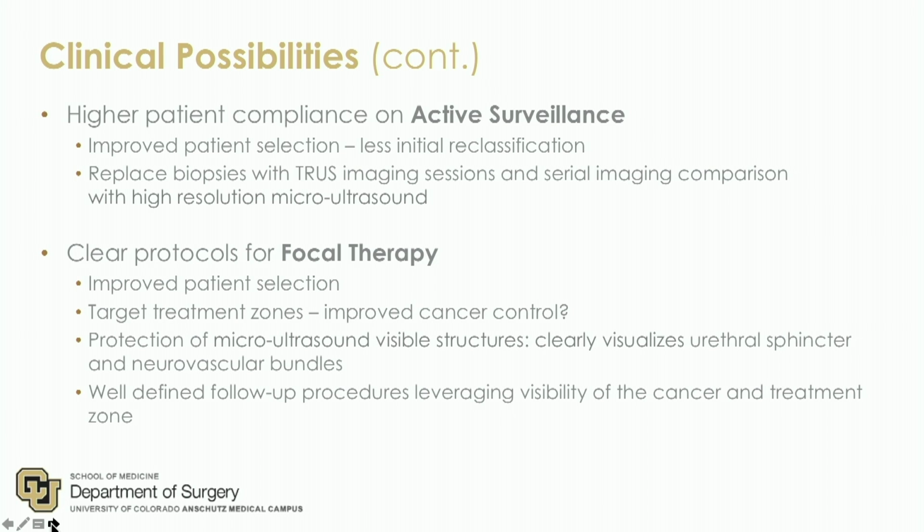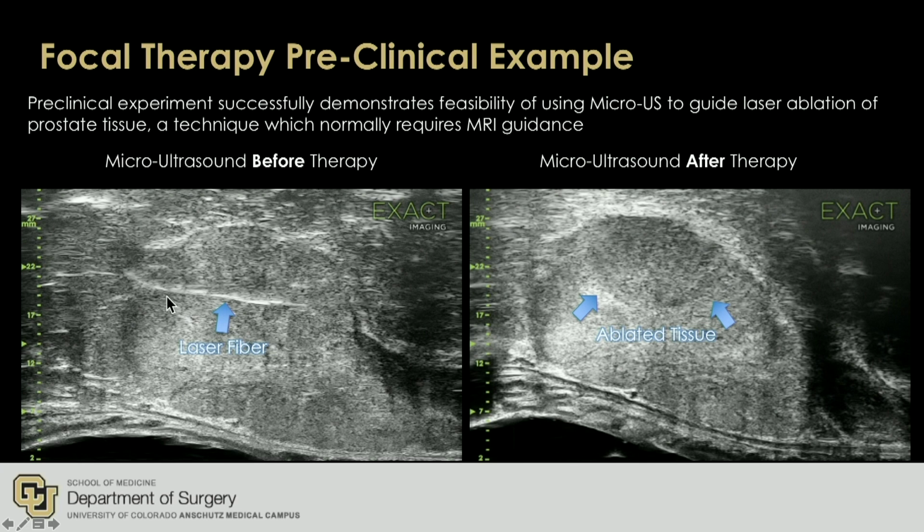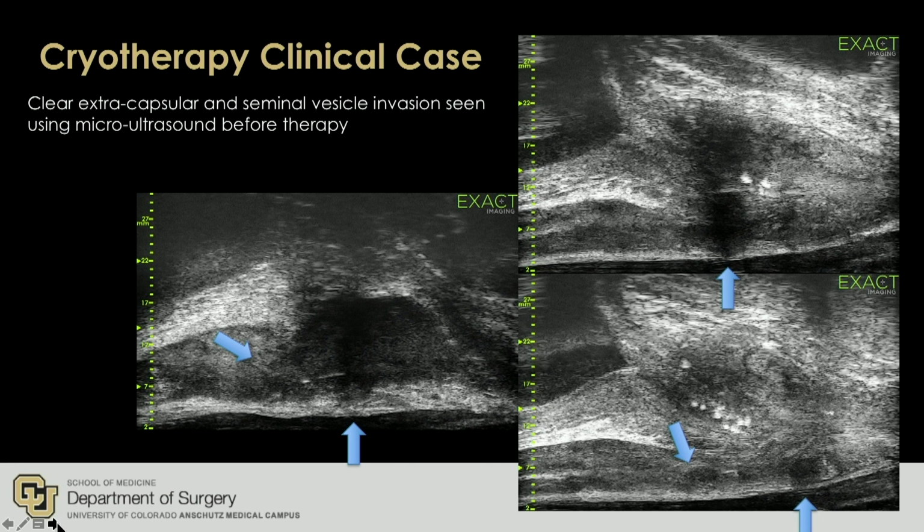So it's pretty interesting. People are also doing lasers. Here's a laser fiber. Here's an example of ablated tissue with lasers. Now, one of the other things of interest is cryotherapy.